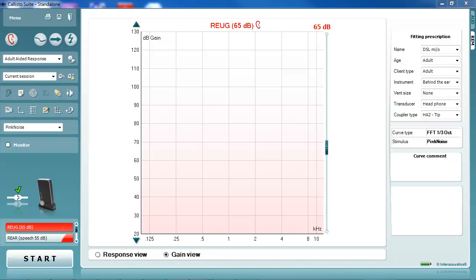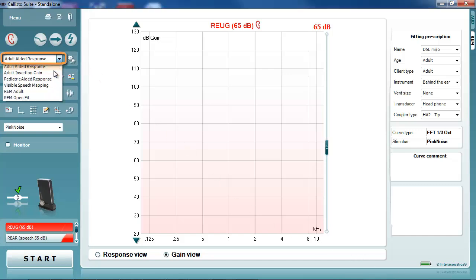In order to do this, it is first necessary to select a protocol which includes the calibrate for open-fit test. Use the protocol drop-down list to select such a protocol.